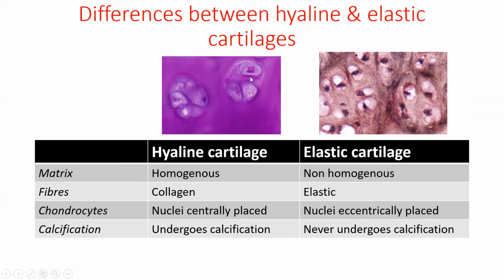Here the nuclei are centrally placed and there the nuclei are eccentrically placed. Hyaline cartilage undergoes calcification, whereas the elastic cartilage never undergoes calcification.